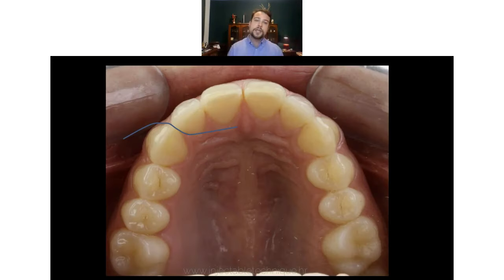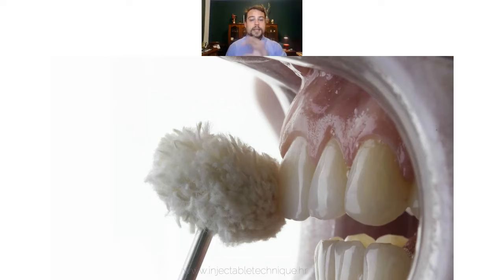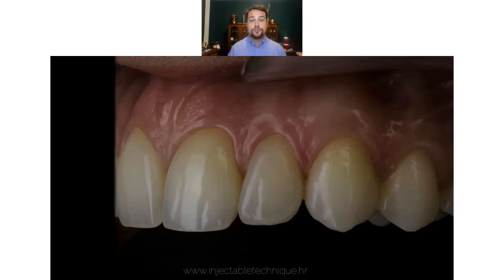With this S formation, in one orientation, if I am polishing lateral on this slide, you will be polishing more palatal, and here you will be polishing more the vestibular surface of your veneer. For the final gloss, I like to use some flexible spirals on low RPM, without water cooling for better friction. And for the final touch, I like to use polisher paste in combination with a cotton buffer like this one. And this is all that you need to achieve a nice gloss of your restoration.